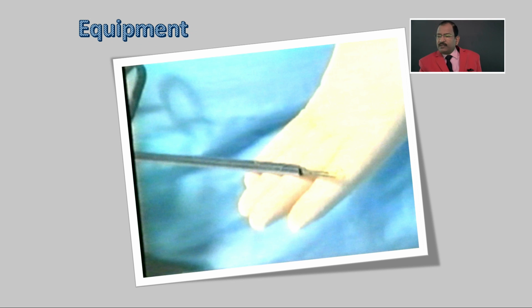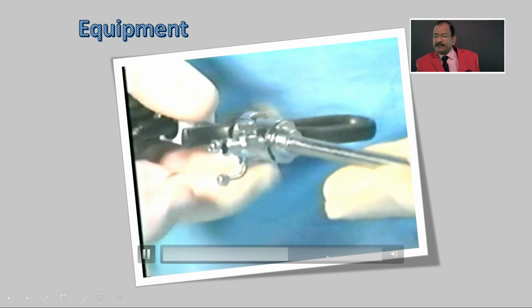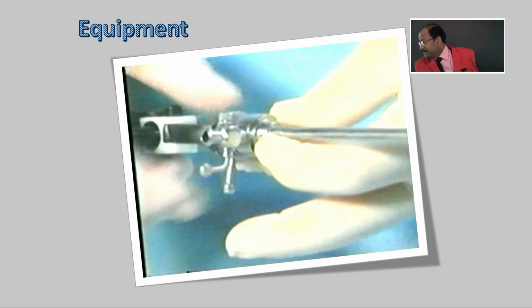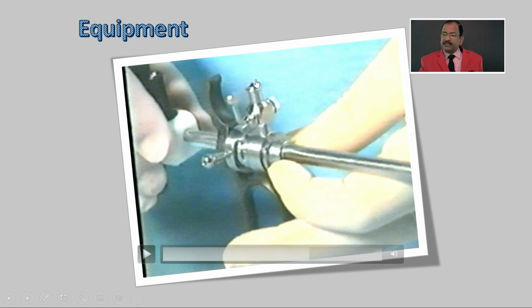So this is how you will introduce the electrode to the working element first. After that, you will push the inner sheath. This is the inner sheath, and rotate clockwise, it is locked. The inner sheath has two purposes. One is at the tip, there is a ceramic tip which acts as an insulation. Another advantage is that it acts as a fluid input here. You will attach the fluid input. In this channel, you will attach the Luer lock, and that has the fluid input.